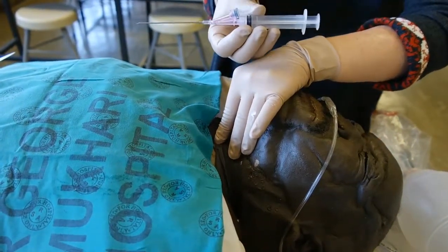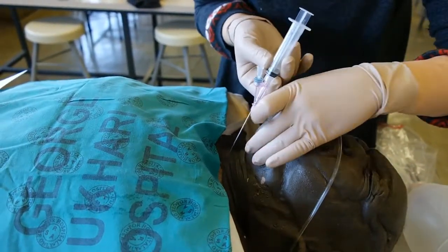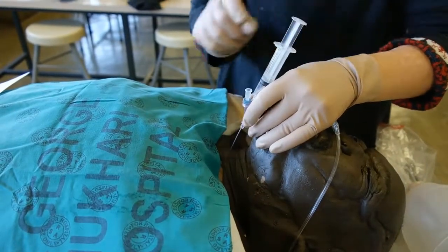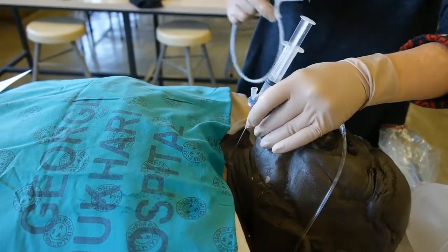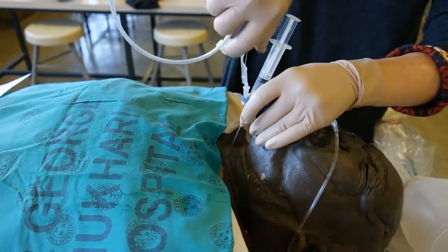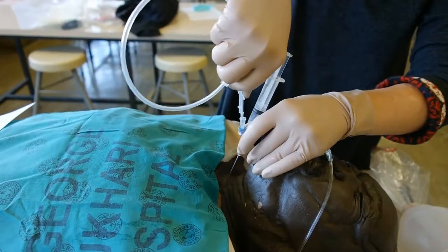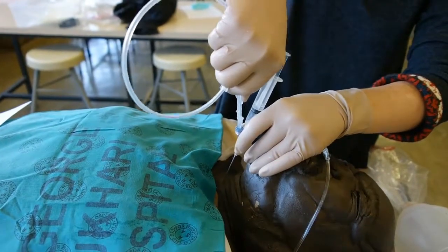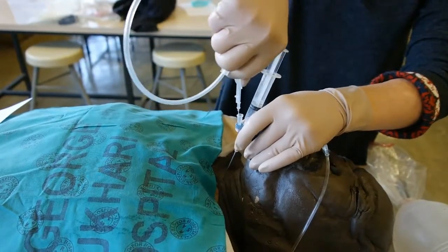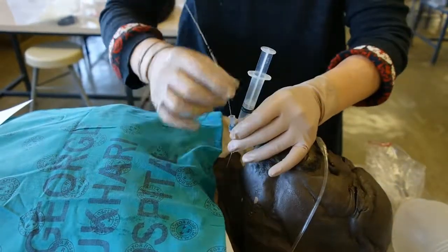Using the needle and syringe from a CVP pack, puncture the cricothyroid membrane. Aspirate to ensure that you are in the trachea. Use the guide wire and place the guide wire into the trachea. Aspirate again to confirm placement in the trachea, then remove the needle.